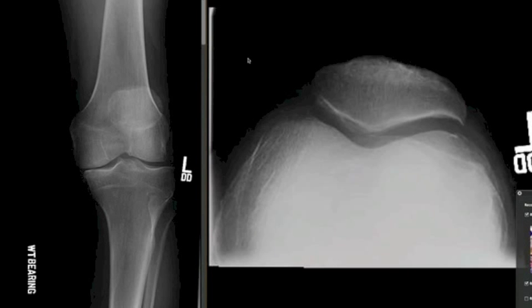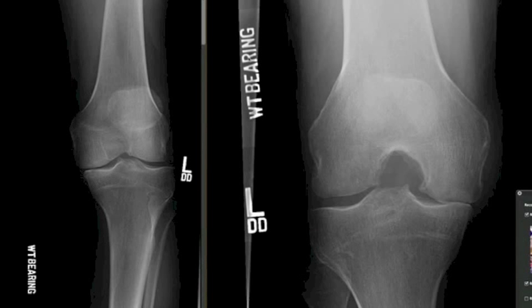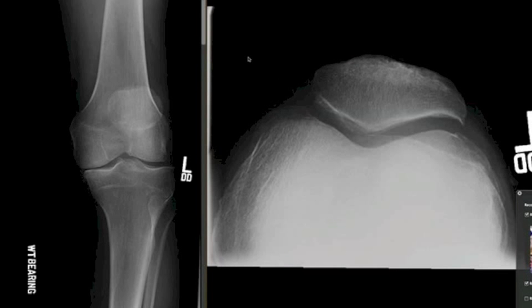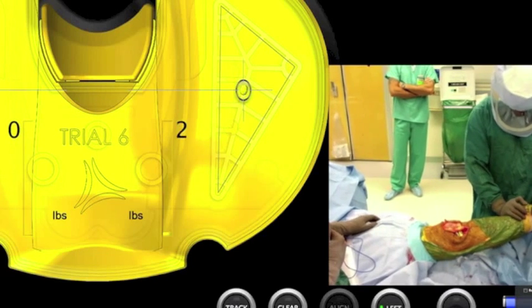This next case is a 65-year-old male with severe varus disease both in his extension and flexion gap. We will perform a total knee replacement utilizing sensors to depict the overall alignment of the knee, its effect on soft tissue balance, as well as rotation.